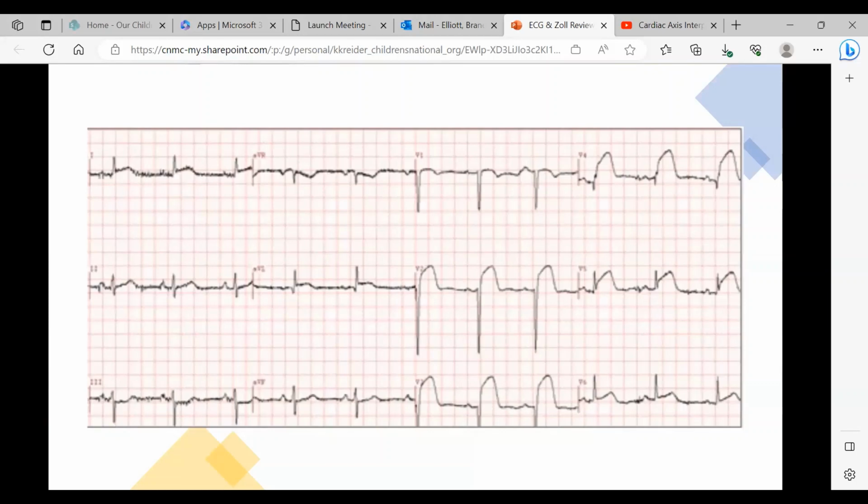Okay. So what part of the heart do we think is being affected? That's what I was in the middle of doing when you called me. I was trying to find the piece of paper that says which of these match to which part of the heart, because I definitely don't have that memorized. It's just a force of habit, once you put your 12 lead out, to consistently write in where the affected areas are.